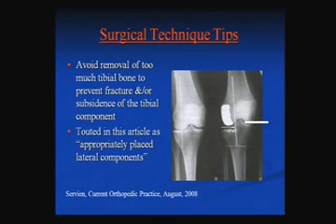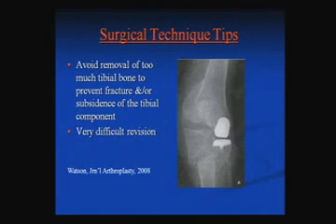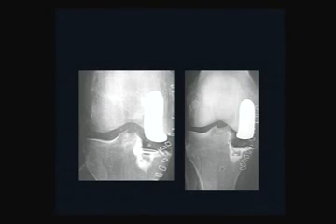Again, I think this is too inferior. It results from taking too much tibial bone, not taking enough femoral bone. And this one's obviously a nightmare to repair. So this is really critical to do, and I'm going to explain to you why in just a second.